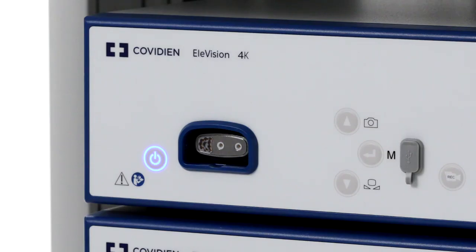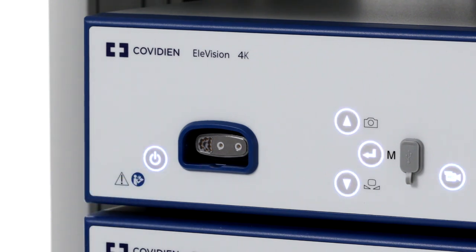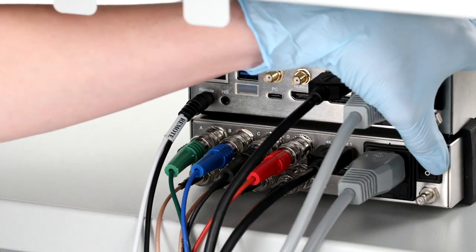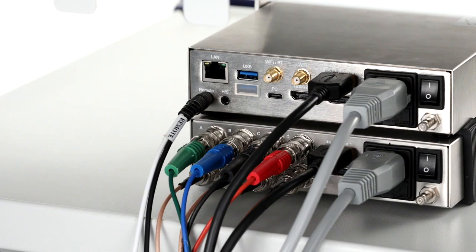To power on the CCU, you'll need to press the on/standby button on the front of the device. You can also switch on all supplemental devices at this time, such as a recording device.